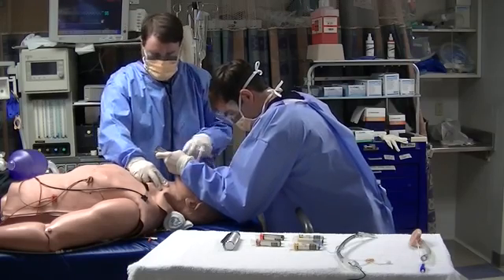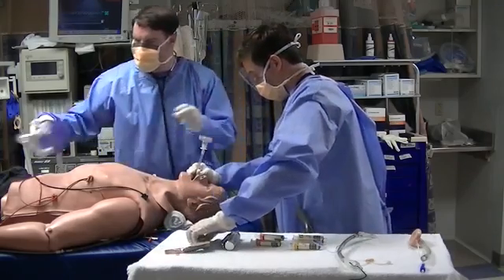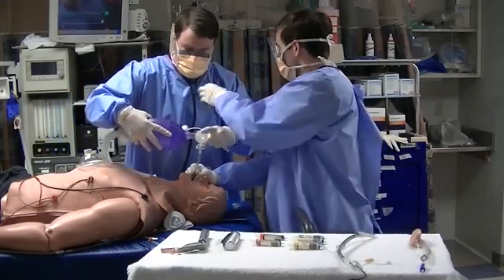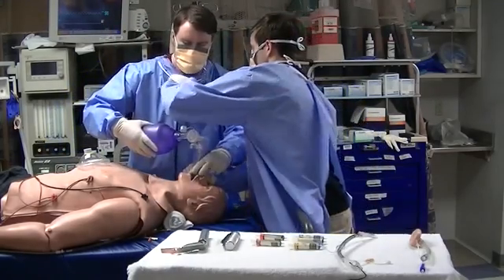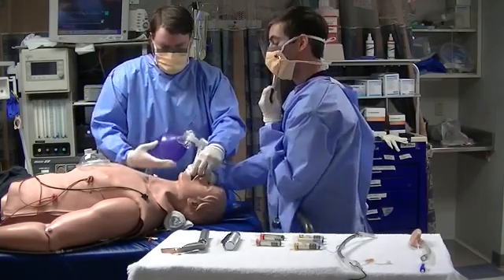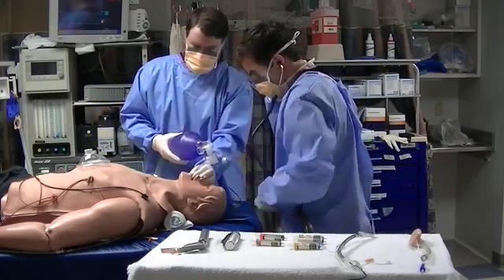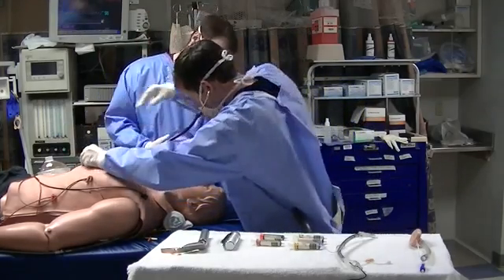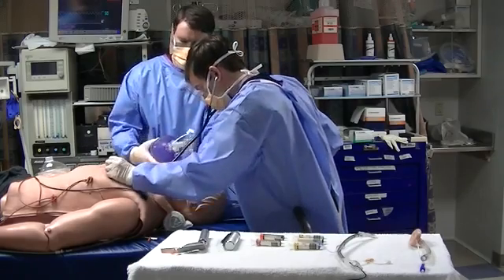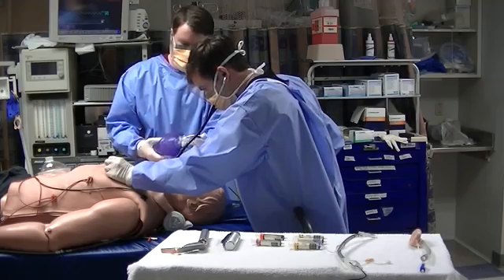Once the provider is satisfied with ET tube placement, the stylet is removed and the colorimetric end-tidal CO2 device is attached. The bag valve mask attaches to the end-tidal CO2 and a couple of breaths are given to confirm placement in the respiratory tract. The provider then auscultates over the stomach to ensure no breath sounds are heard there, then places the stethoscope over both lungs to confirm bilateral breath sounds.